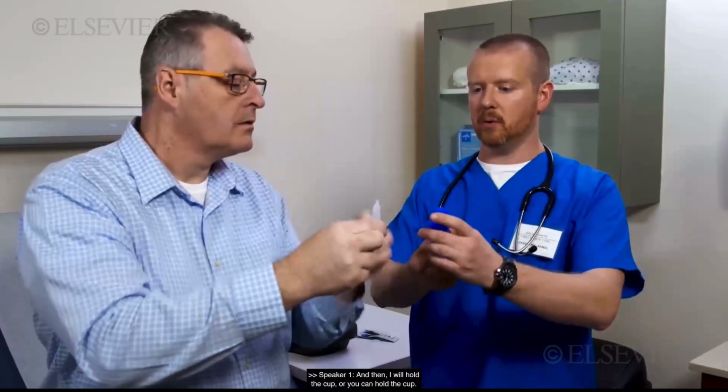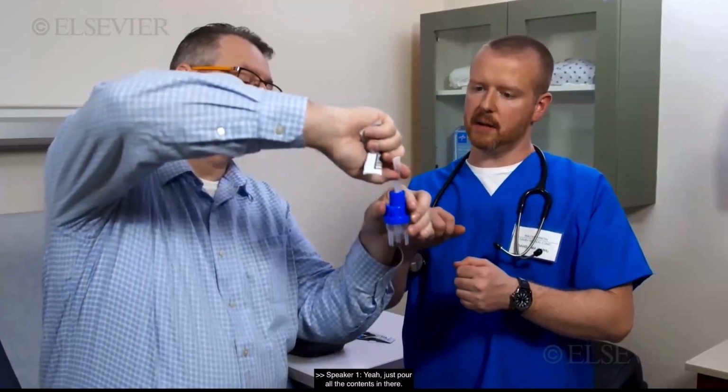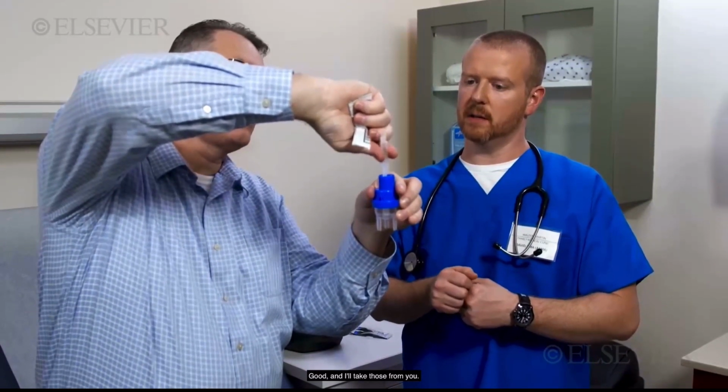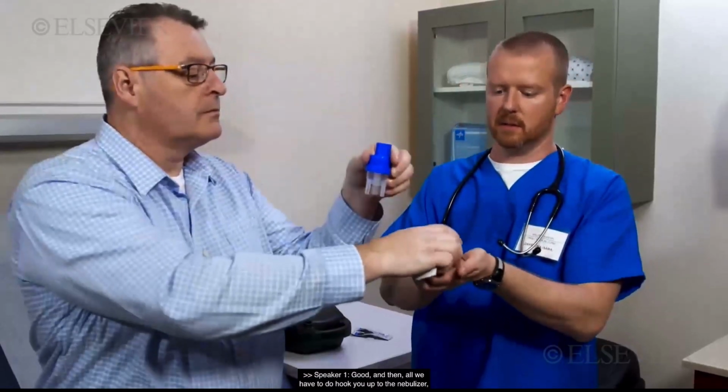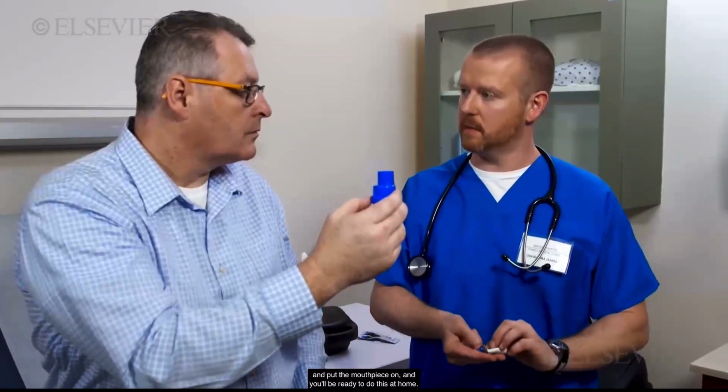And then I'll hold the cup, or you can hold the cup. There you go. And I just put it right in there? Yeah, just pour all the contents in there. You'll need all that medication. Good. Here, and I'll take those from you. And then all we have to do is hook it up to the nebulizer and put the mouthpiece on, and you'll be ready to do this at home.